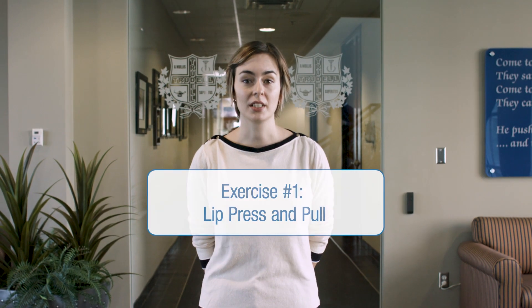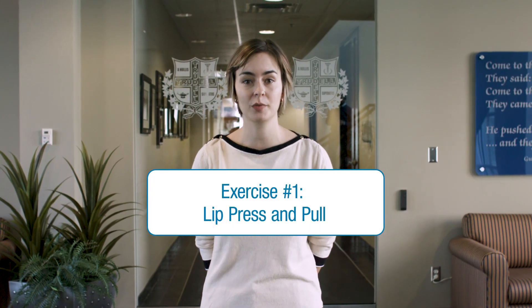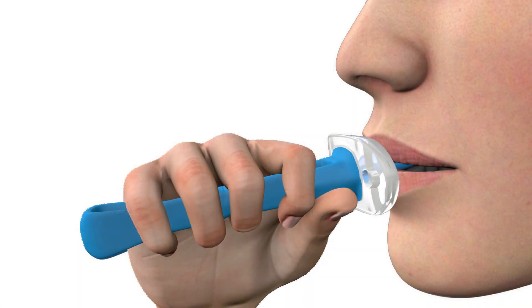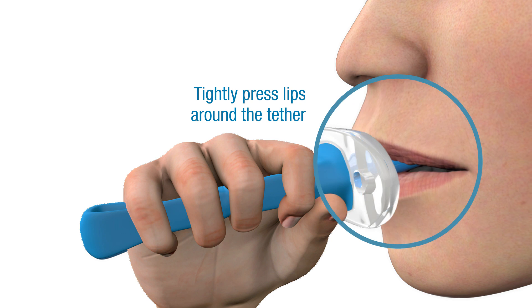The lip press and pull is intended to strengthen and improve lip control for proper lip seal and coordination. To start, tightly press your lips around the tether of the Ablex, keeping the bulb firmly inside the mouth using only the lips.